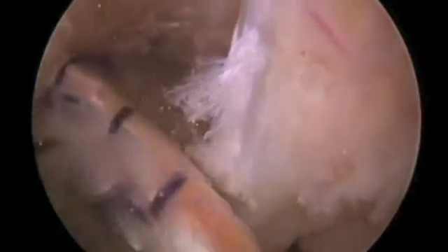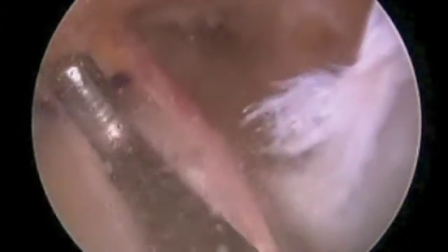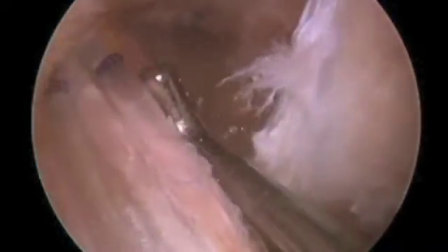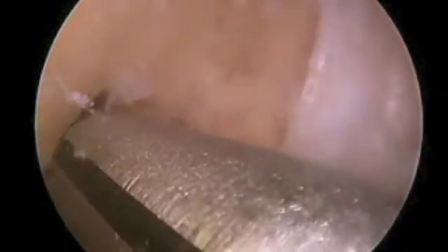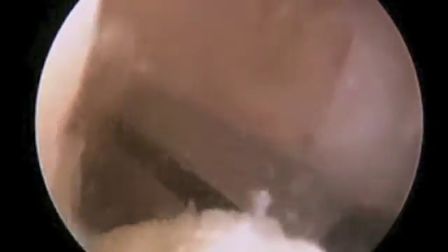Here is an anterior tibialis allograft that I've utilized, and I use a hybrid type technique. I think aperture fixation is very important. As I pass that graft, you can see I've created essentially a posterolateral bundle below the pin and an anterior medial bundle above. So my fixation device — I like to use the Mitek Intrafix system, which is an aperture fixation device. The screw doesn't necessarily touch the graft itself, so you don't have to worry about the graft winding up in the screw and getting damaged by screw fixation. Part of my technique has always been aperture fixation — I think that's important. A lot of the biomechanical properties of the graft are optimized in that situation; properties such as creep and elongation are minimized.